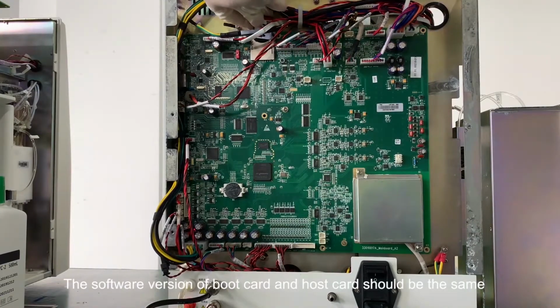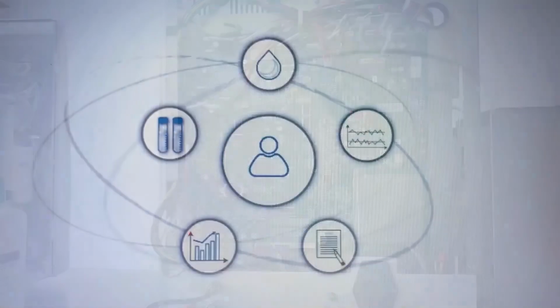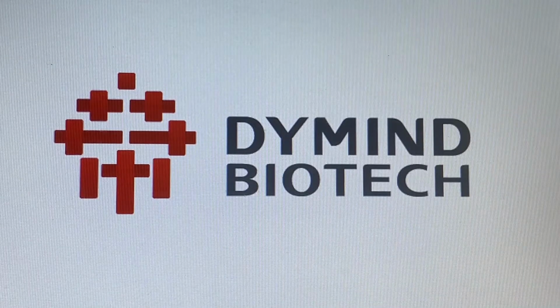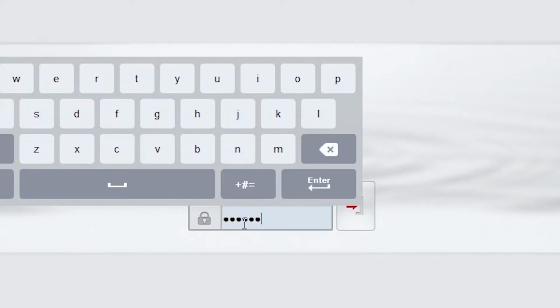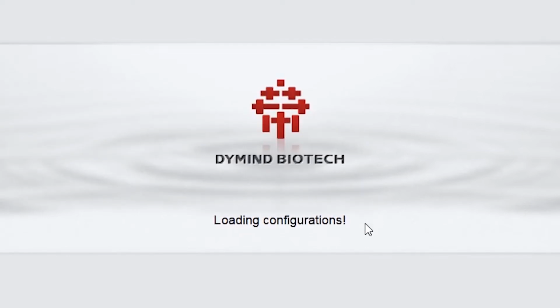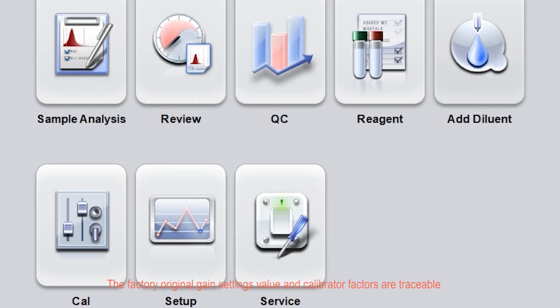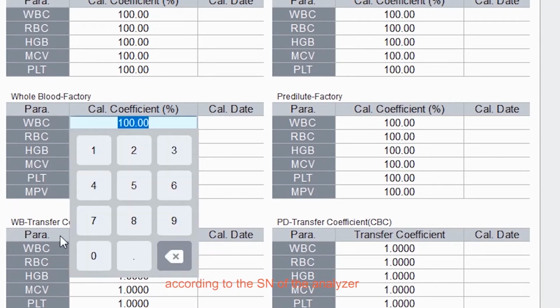The software version of boot card and host card should be the same. Power on the analyzer. Log in the analyzer as service to restore the gain value and calibration factors. The factory original gain settings value and calibrator factors are traceable according to the SN of the analyzer.